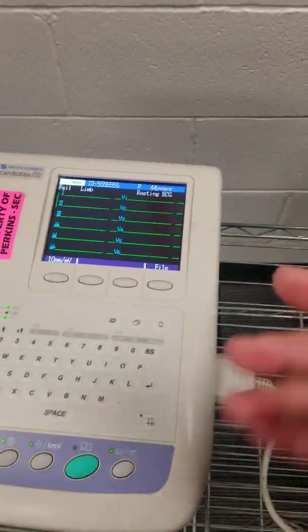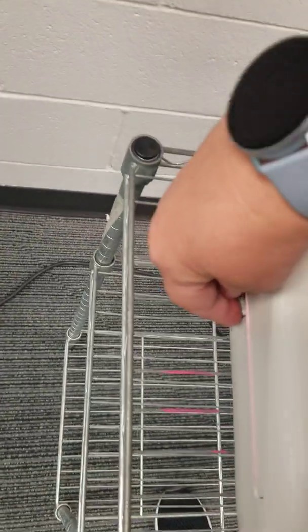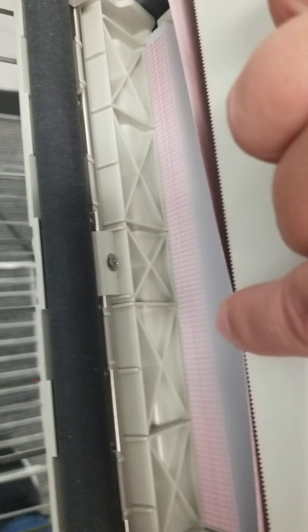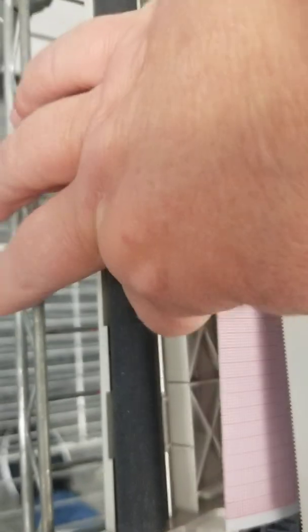Some other things that you want to know: over here on the side is where you open it to get your paper changed. We use Z-fold paper that would have to be applied in there.